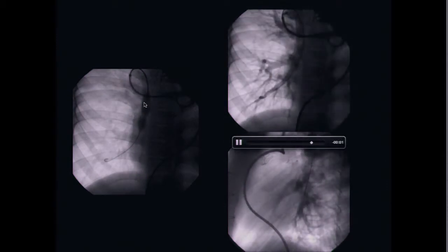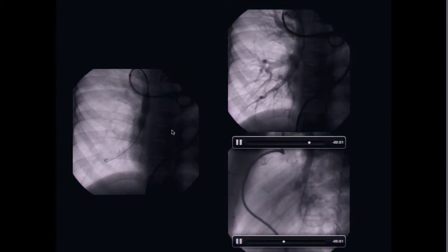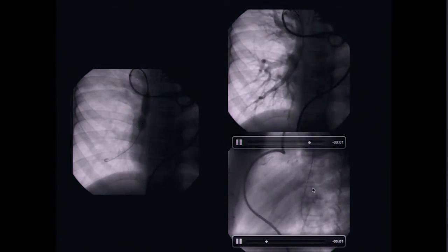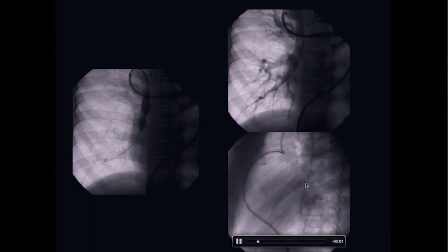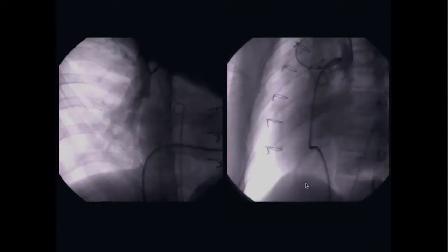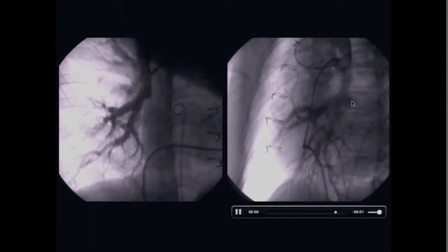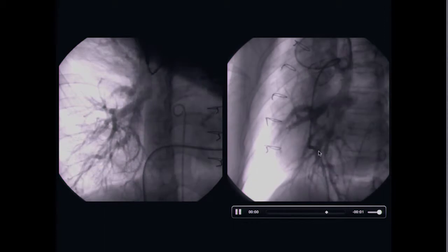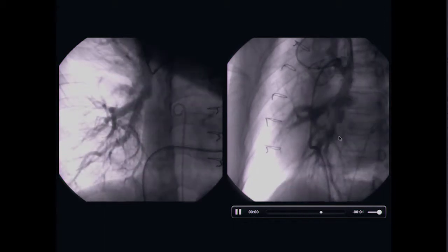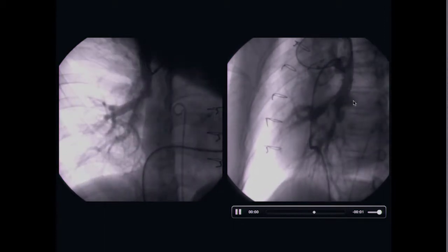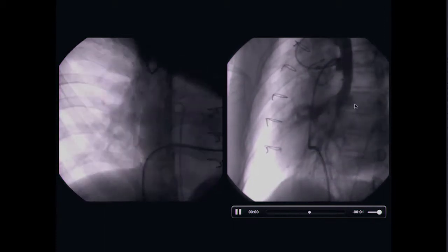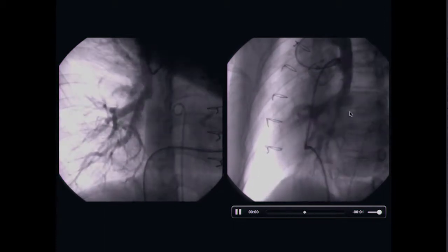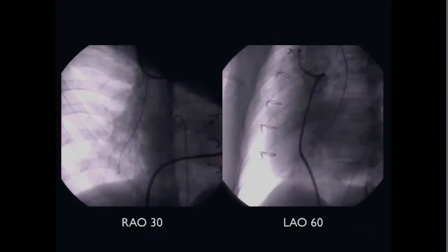So I used the long sheath approach to this stenotic vessel, and balloon angioplasty was performed. But unfortunately, after this, a dissection occurred, and as time passed it was aggravated — the distortion was aggravated and the aneurysm size became a little bit bigger.